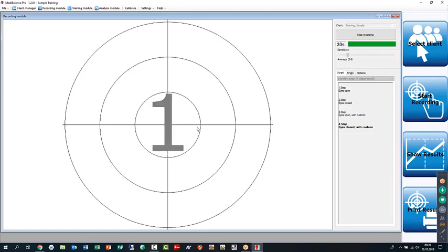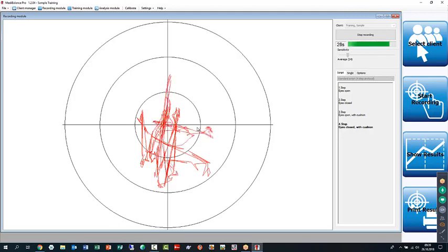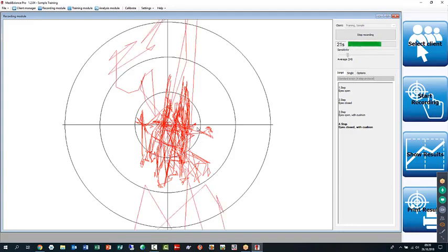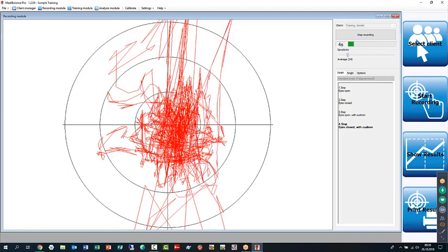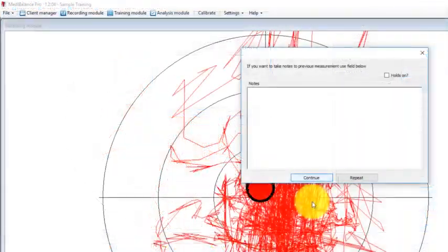Standing on the platform again. And now this client is so unstable. Okay, this is very pathological, but you will see people doing something like that. Yeah, so this is something where people are so unstable that they no longer have a very distinct movement pattern front left, but they actually have a lot of shocking movements like this one. So now that is done with, and this will be very pathological. I'm sure we'll see what the findings are.